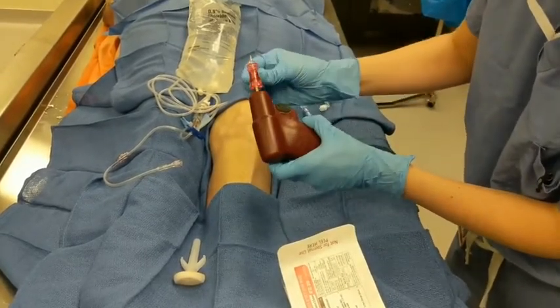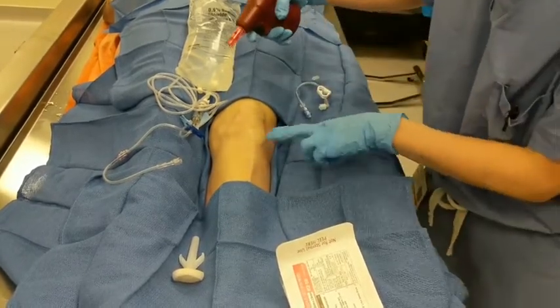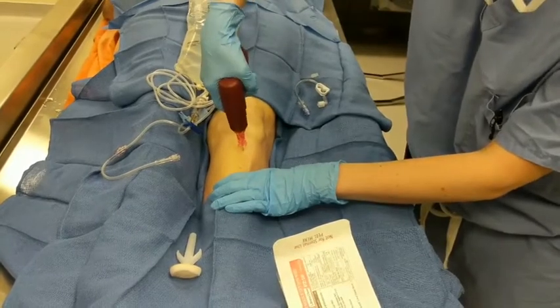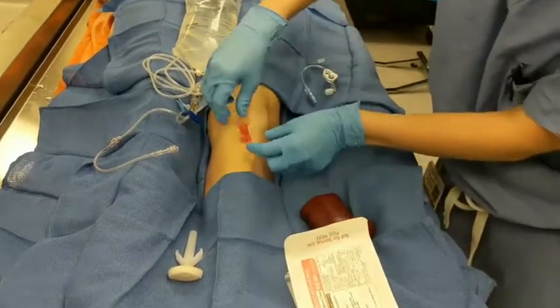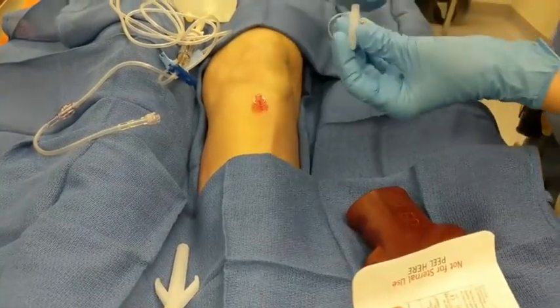The needle should slide easily into the needle driver and lock when secure in place. The needle driver should then be grasped firmly and placed at a 90-degree angle to the correct anatomic landmark. Steady downward pressure should be applied until the needle is in place. The needle driver and inner needle can then be removed at that time.